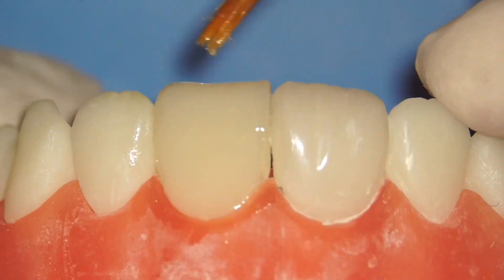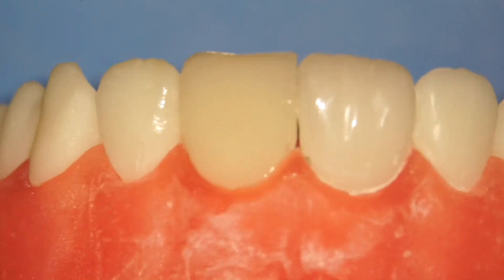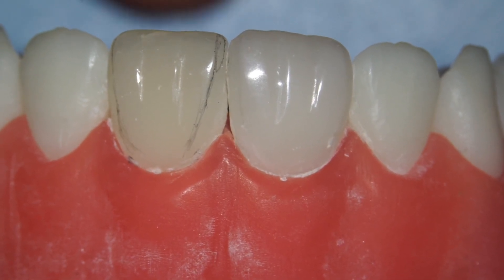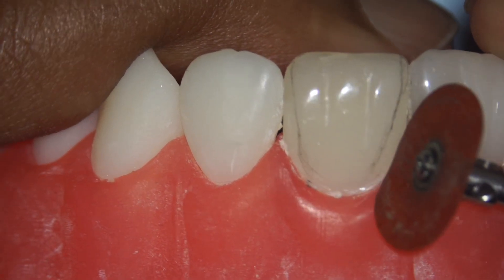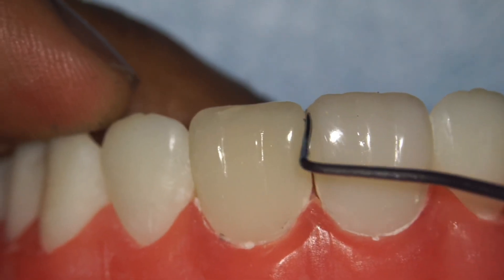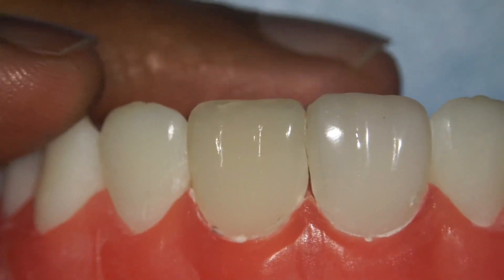That brings us to the end of Part 2 — we've added all the enamel layers. In Part 3 I'll be showing you how to finish and polish and get a lifelike restoration. Join me in Part 3, I hope you've learned something. Let's take it slow and steady in this series — see you there!